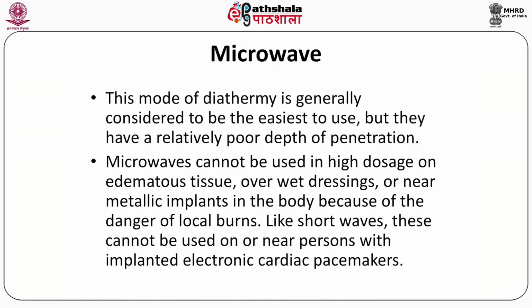Most of the therapeutic effects of microwave therapy are attributed to the conversion of energy into heat and its distribution throughout the body tissue. Continuing with the microwave, this mode of physical therapy using diathermy is generally considered to be the easiest to use, but it has a relatively poor depth of penetration.